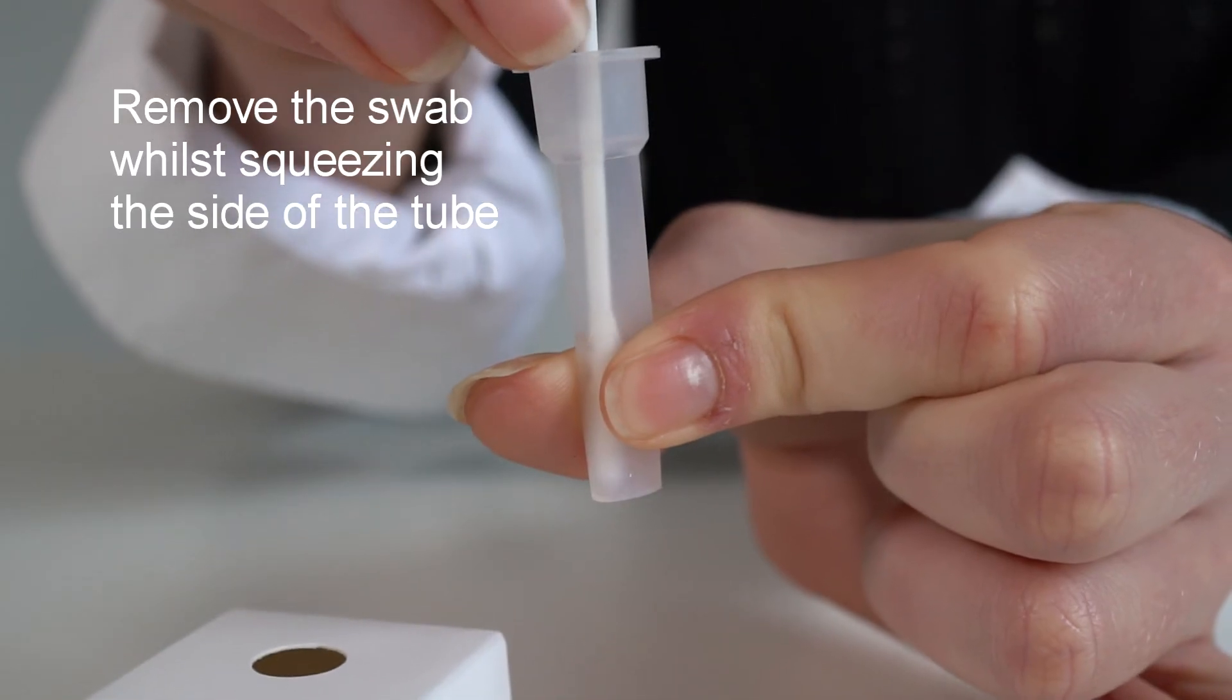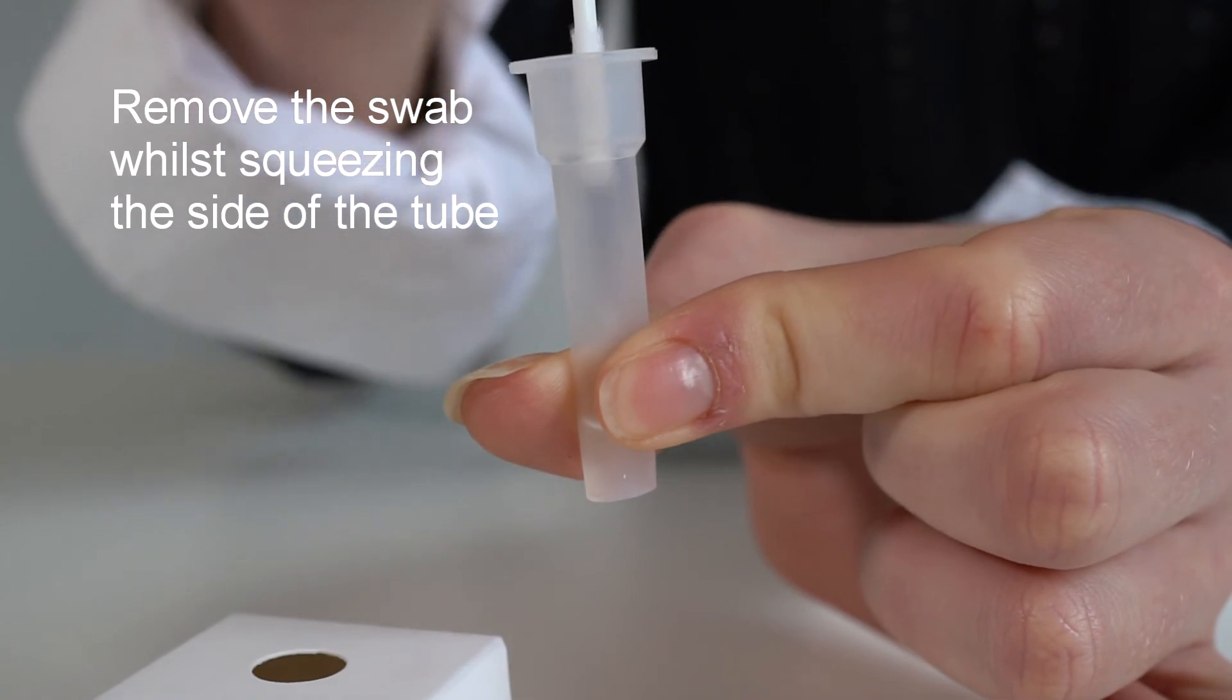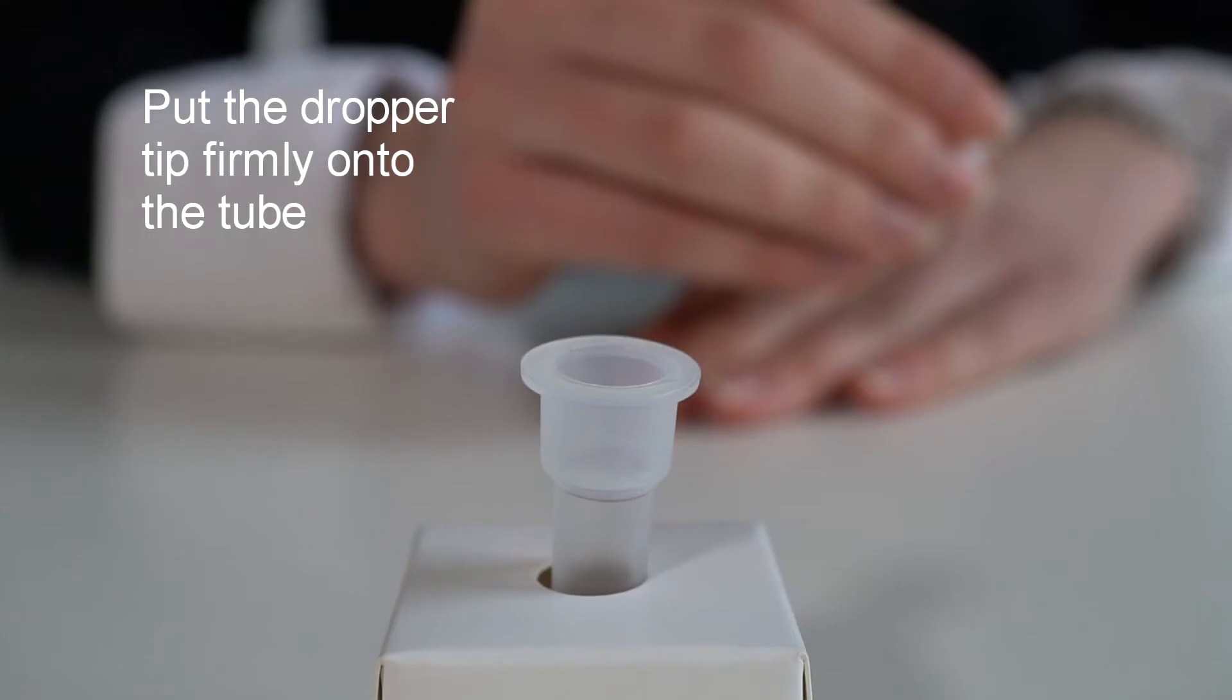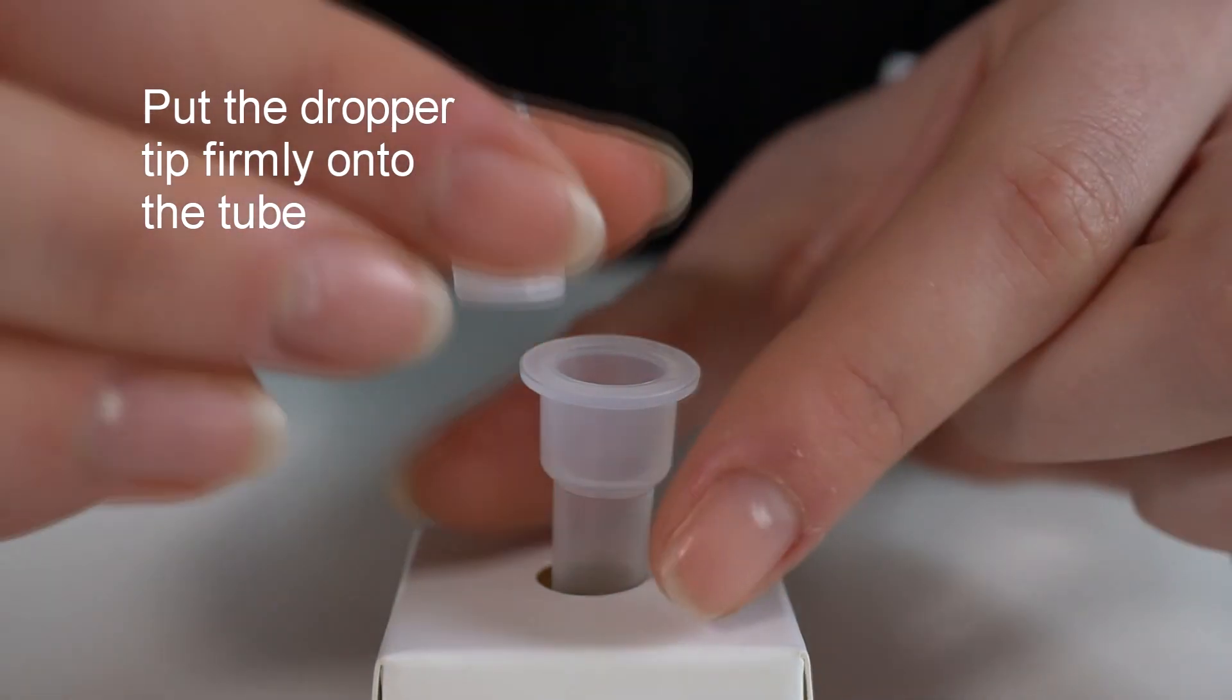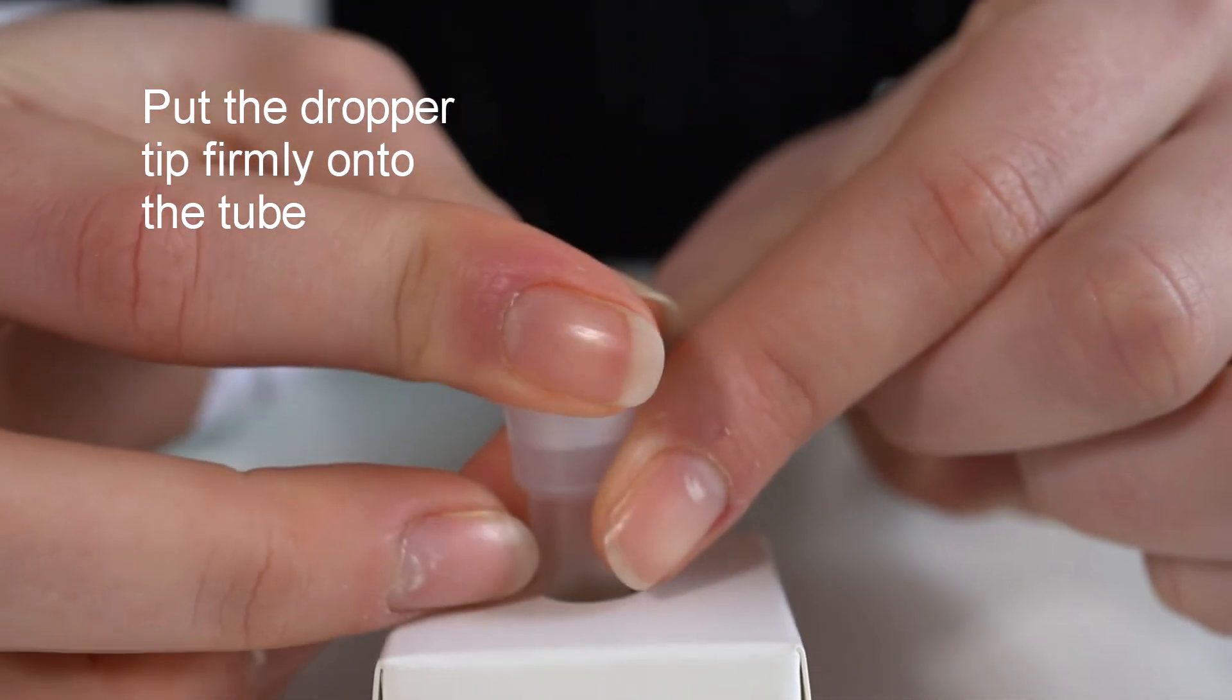Take the swab out of the tube by squeezing the sides of the tube tightly together. Take the nozzle and place it on top of the extraction tube.